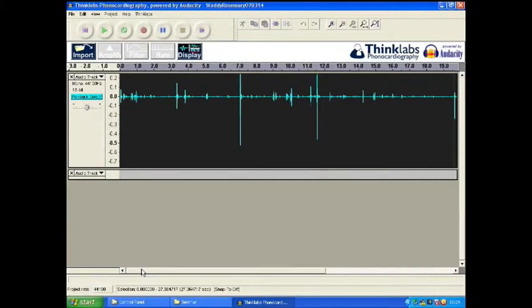This is an arrhythmia. Okay, you've got it all over the place. This is your typical one that needs the B4. Okay? So the B4 is the one that brings the rhythm back in, along with the B1. Now B1, you can start recording now.